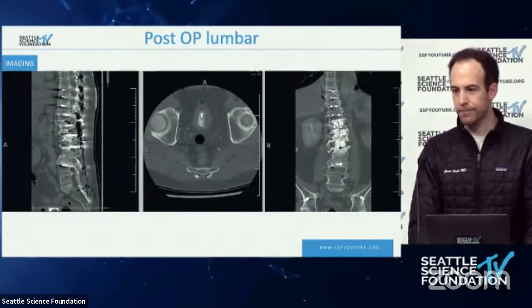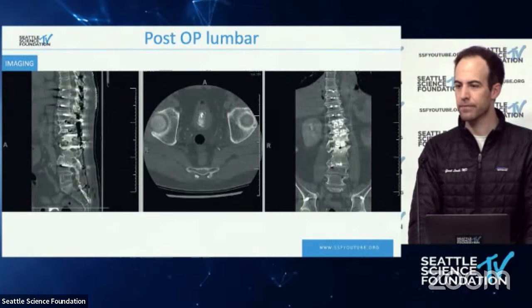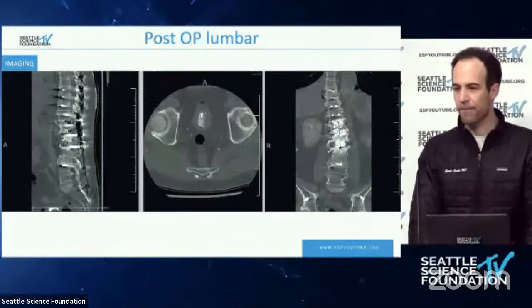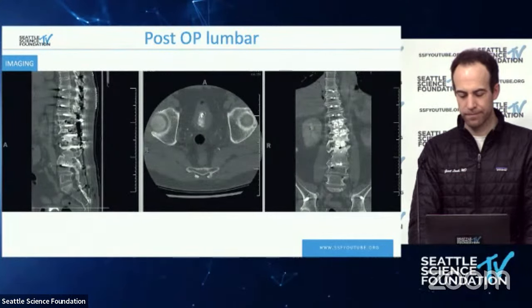So in terms of deformity correction, we worked very hard. We pried them apart very hard, but we were not successful in getting a full lordosis. Do you see it as a problem? Would you have had any technical tricks or tips to get more lordosis out of him? Yeah, no, I think that's the million-dollar question in a lot of these cases. You get in there, you have a good plan to do it, and it works in most cases, but then the patient's just not compliant, as far as their anatomy.